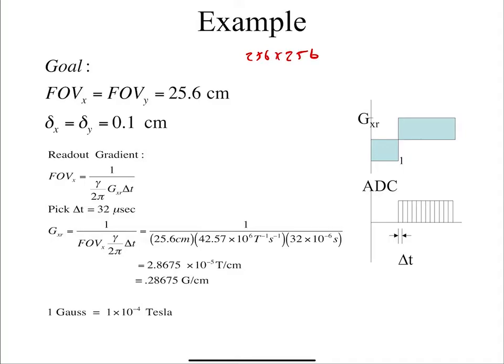If you knew nothing about MR and you hadn't taken this course, what would be your best guess for how many samples you should acquire in k-space? It's 256 by 256, right? That's ignoring factors like complex and things like that, but that's a good rule of thumb. If I said I can give you a 256 by 256 image with only 100 samples in k-space, what should you tell me? Would you like the image I give you? Given what we've talked about, no, but in a few weeks we'll show you why that might actually be okay. But for now, it's not okay.